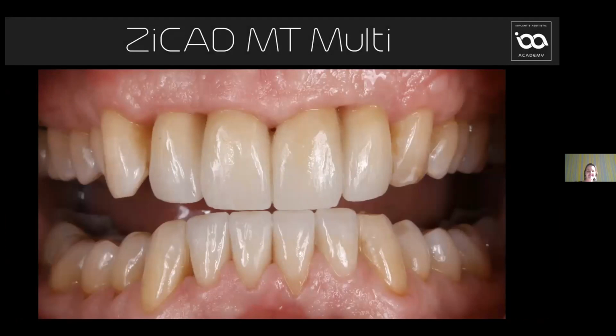Look at the soft tissue thickness of these restorations at the top and the bottom. Yes, we've lost the papilla between the 2-1 and the 2-2. But if you think about the alternatives, removing teeth, bone grafting, adding 8 months and 2 surgeries to this, for sure we would have ended up with a pink element.